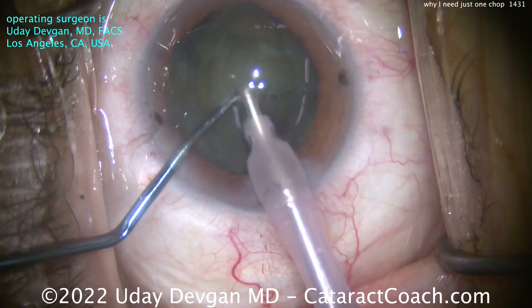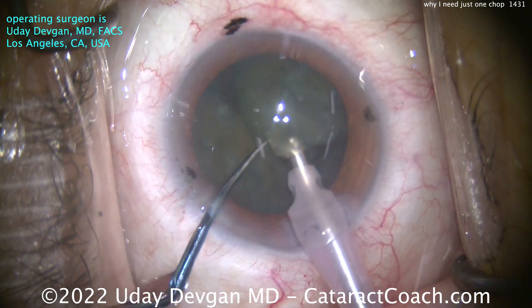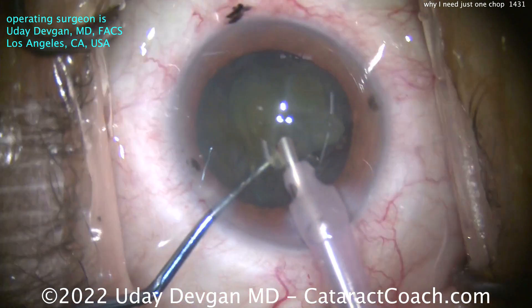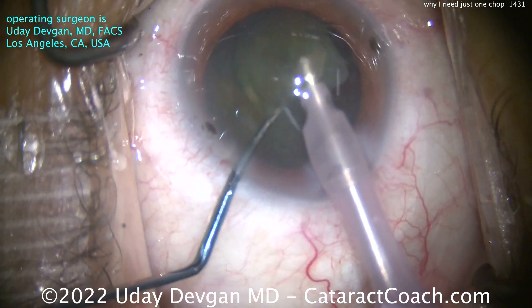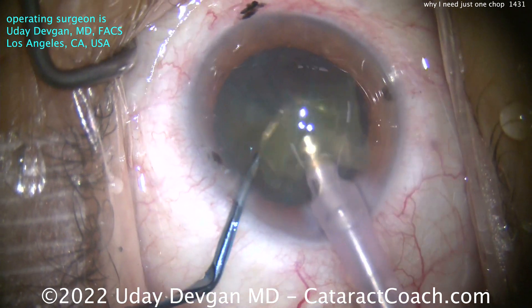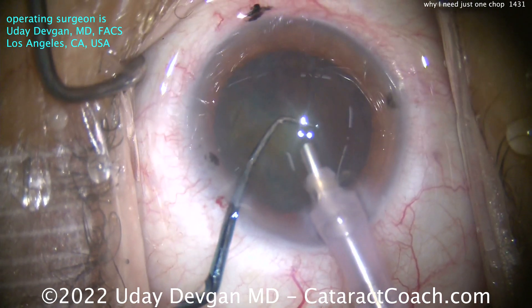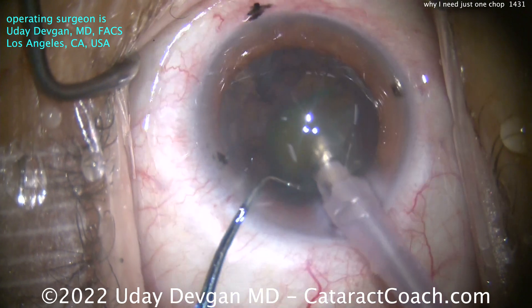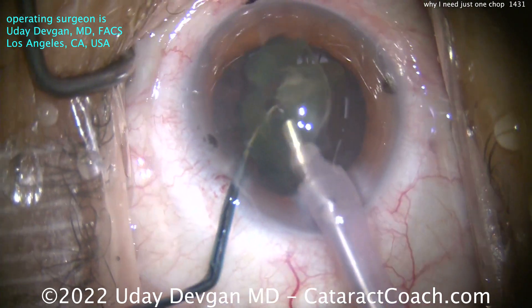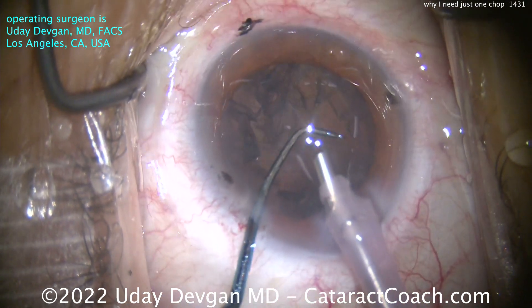The phaco probe with vacuum brings up the second piece. One nuclear half is still in the bag on the left side of your screen, and the one the phaco probe is attacking is at the iris plane. You can see you don't have to do much more chopping — simply occlude the tip and use ultrasonic energy to break it up. Just like that, one nuclear half is gone. The second half comes up out of the bag. No further sub-chopping is really needed — just one chop is all it takes.